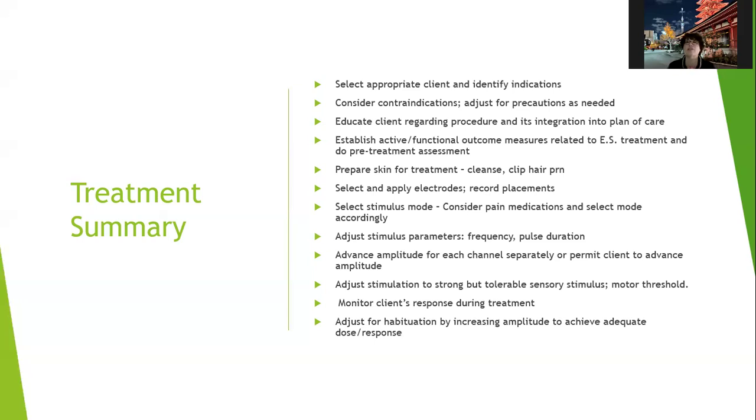So you're either going to cleanse the skin, make sure there are no oils or lotions or anything on the skin, and clip hair as needed. So if people are very hairy, the electrodes aren't going to stick to them. So you might need to clip hair. You want to select and apply the electrodes and record where you placed them, write that in your chart.